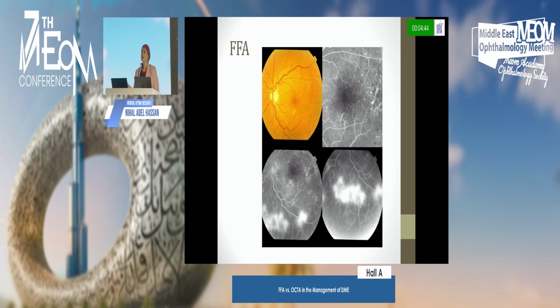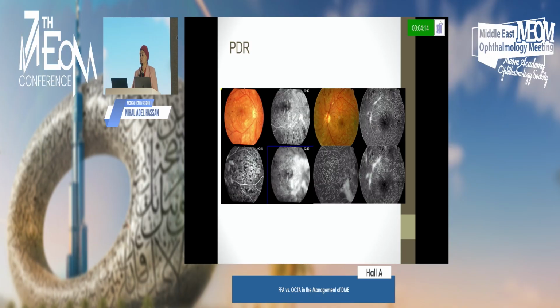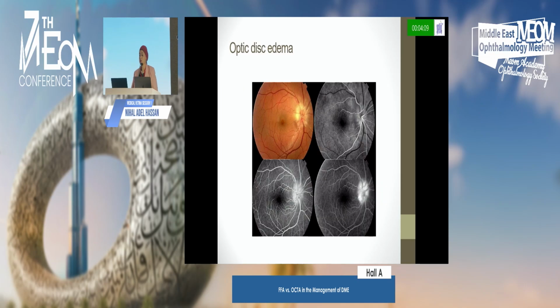But as well, the fluorescein angiography has the advantage of giving all the retinal peripheral details from ischemia to new vascularization and the extent of new vascularization, and to categorize the risk factors for diabetic macular edema or diabetic retinopathy. Also, it's a documentation for the patient and follow-up after laser therapy, and to know the sufficiency, the efficacy of the laser treatment and the deficient areas and the regression of these new vascularization, as in such a case of follow-up after PRP and the regression of the new vessels.